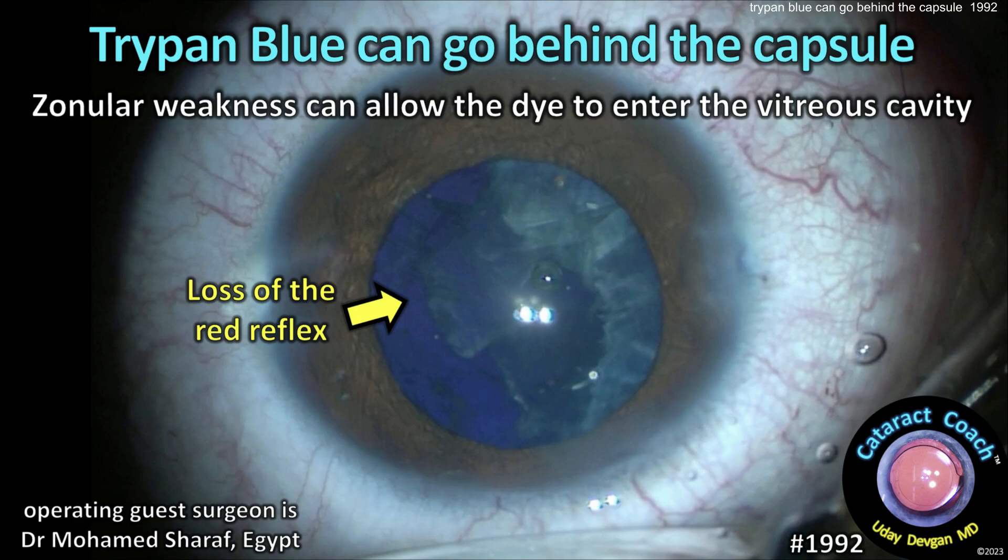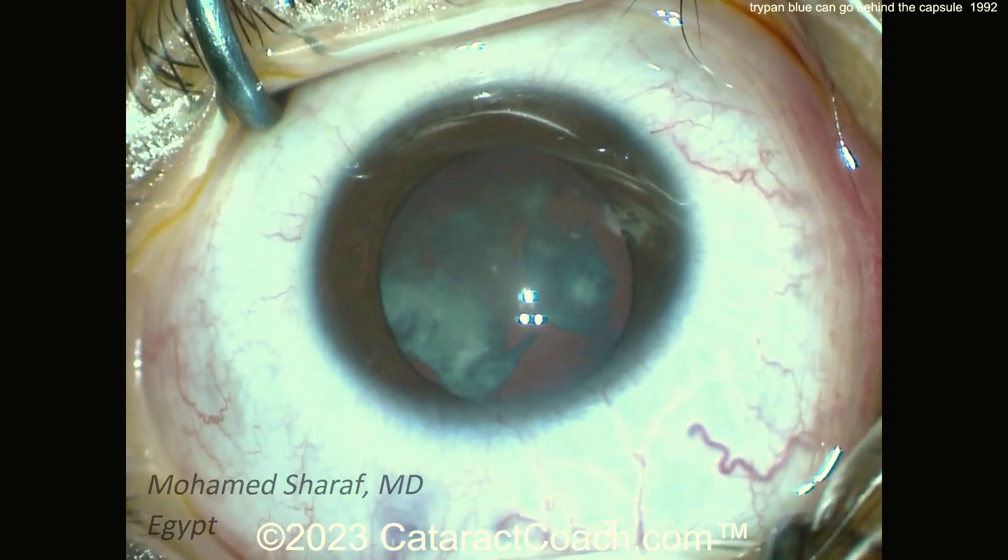CataractCoach.com. Trypan blue dye can go behind a lens capsule — usually it's zonular weakness that allows the dye to enter the vitreous cavity.